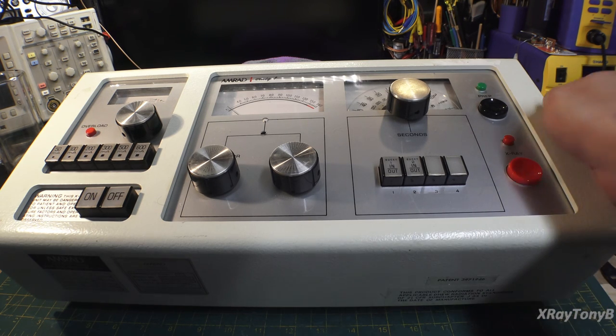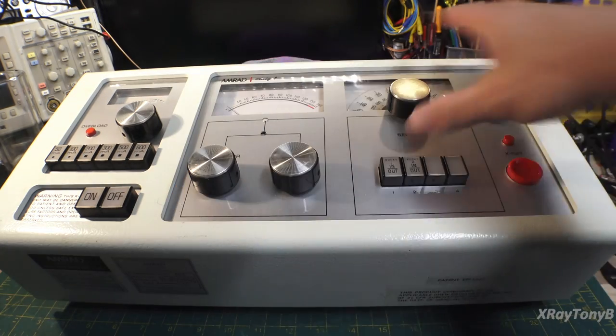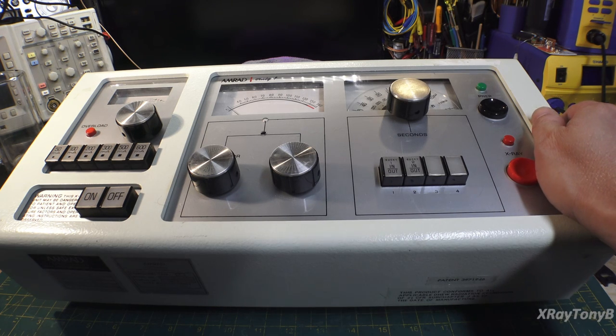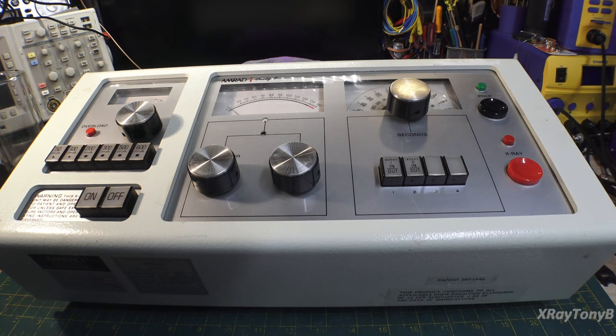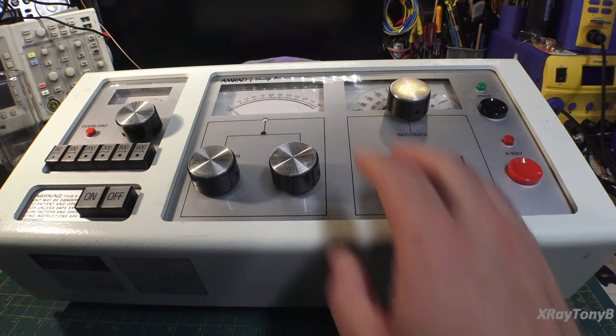And this is an old style single phase X-ray generator. This is just the console from it. The rest of the X-ray machine we disposed of. But I just thought it'd be cool to hang on to this. And I thought I'd just do a little show and tell and show you this. This is not what this video is actually about, but I thought I'd show it to you.